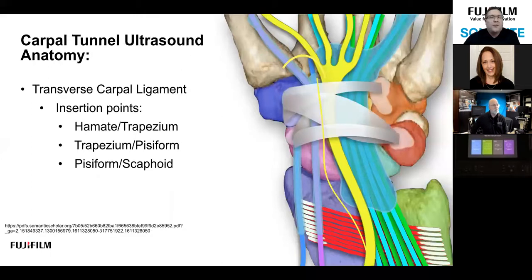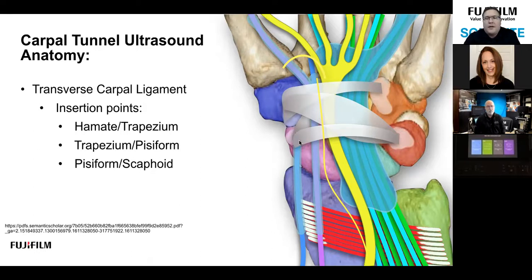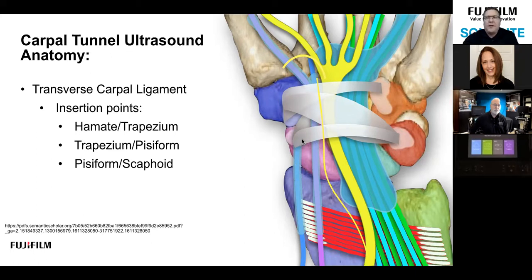You'll notice it looks complicated around the flexor carpi radialis. When ultrasounding, you'll see it almost groups in with it. It travels up and over the flexor pollicis longus and takes a sharp dive down — you'll see a very pronounced black shadow separating the FPL from the FCR once we get to that in the live scan.